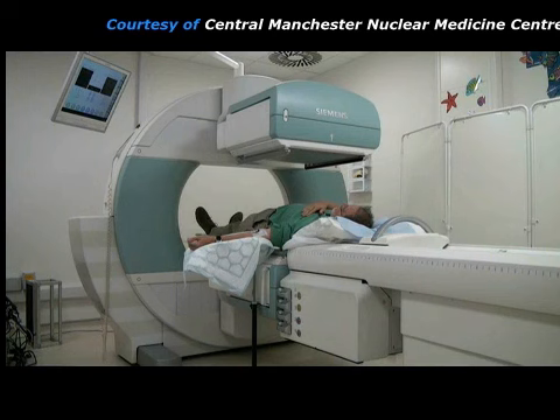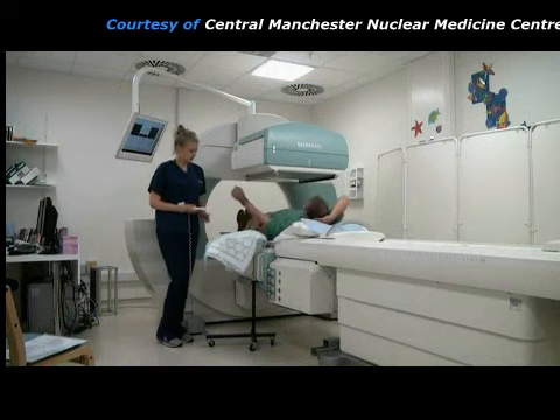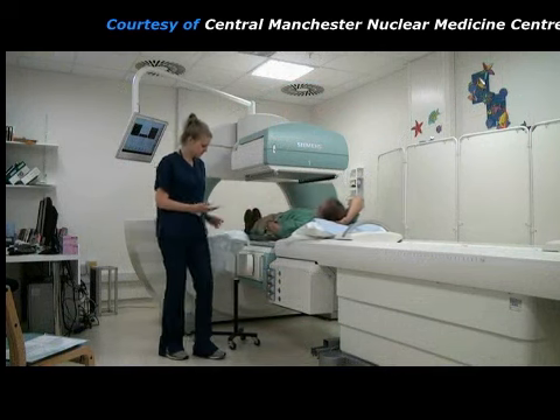The diuretic makes the kidneys work harder and the effect that this has on the renogram gives additional diagnostic information. The renogram may continue for up to 40 minutes and then the couch can be slid out from the camera.